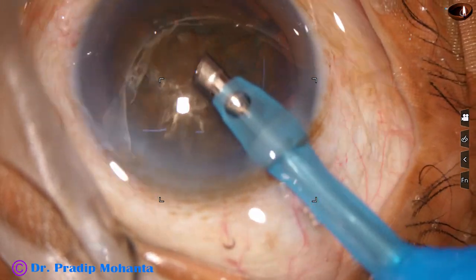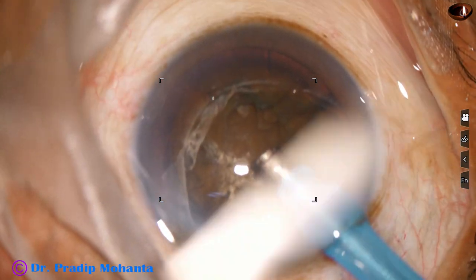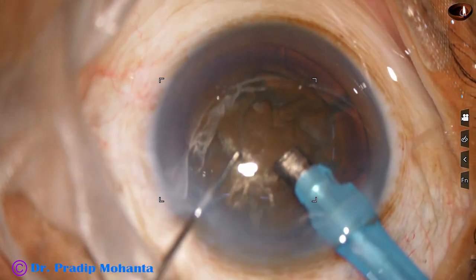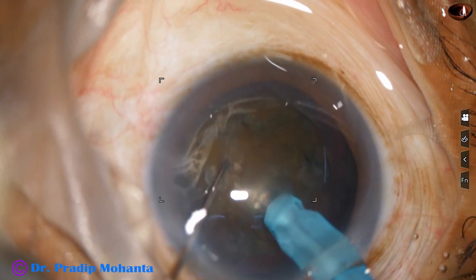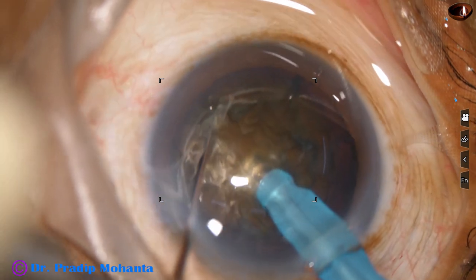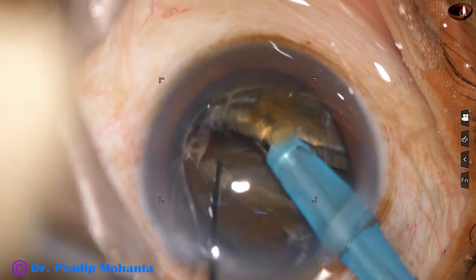See, the cataract is so hard. Nucleus sclerosis is in grade 5. This is a hard brown cataract. And here goes my technique, which I call submarine chop. See how the tip is traveling through the substance of the nucleus.